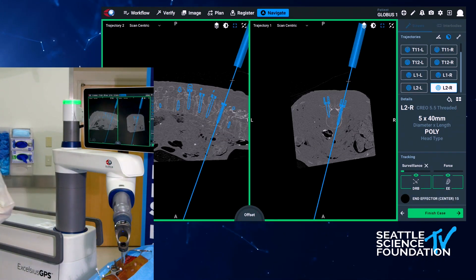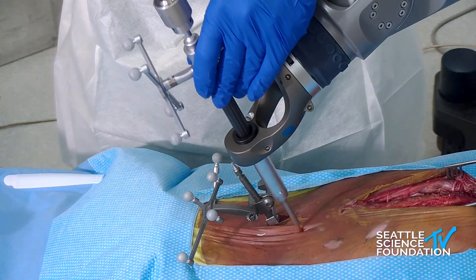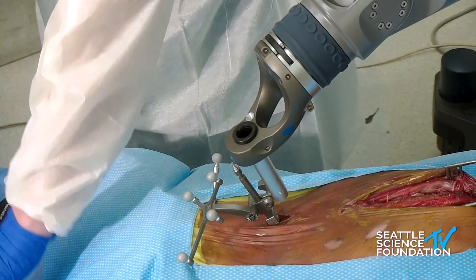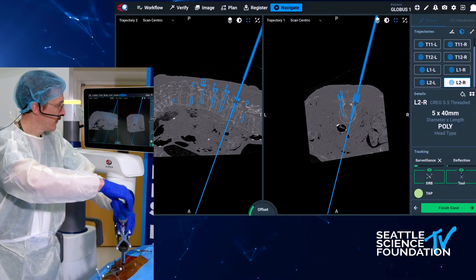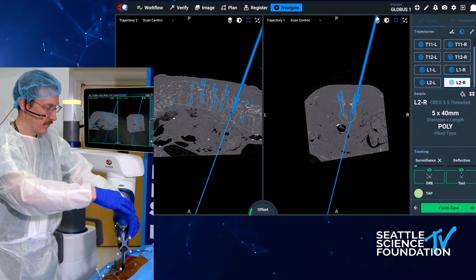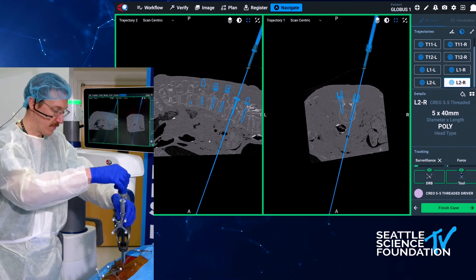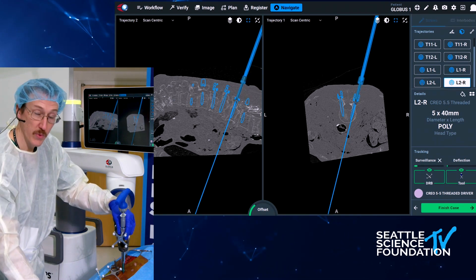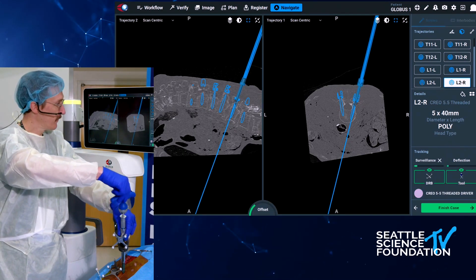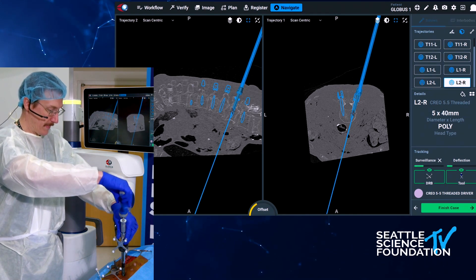Now I'll move on to my drill, then my tap, and then my screw. You may notice that I'm putting these instruments down with the balls facing the table, because if I have the reference frame get in the way, then it loses sight of which instrument it's actually working on. This took our team a little while to figure that out, but ultimately we got it.